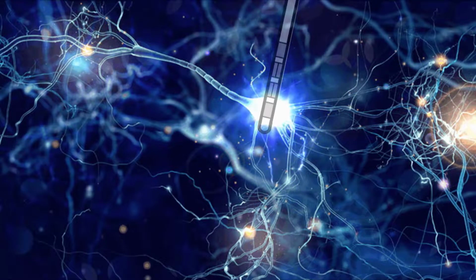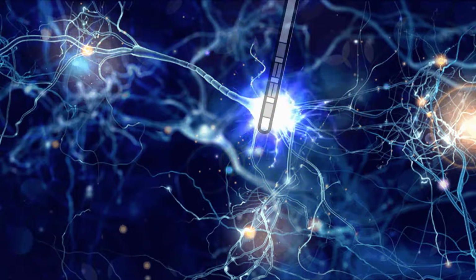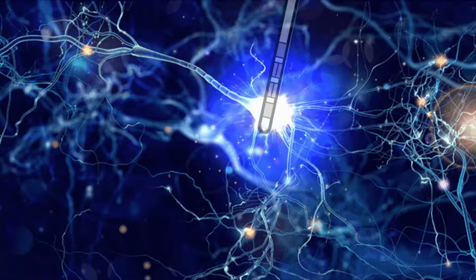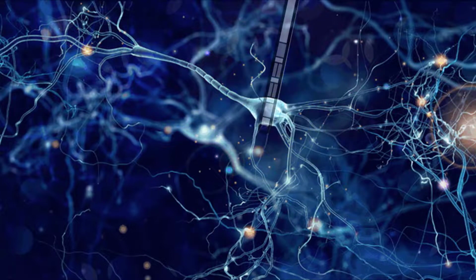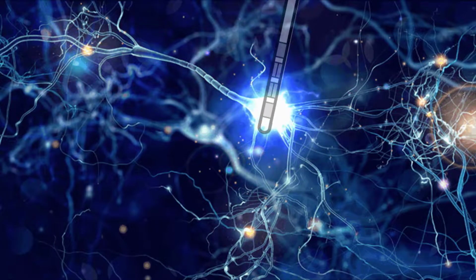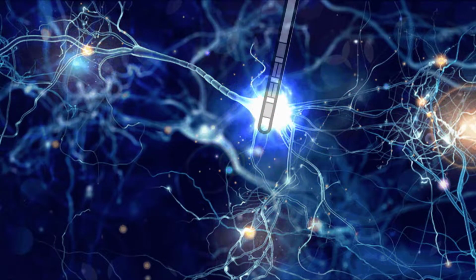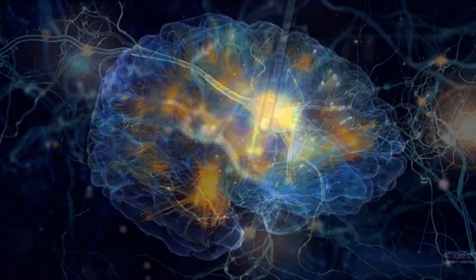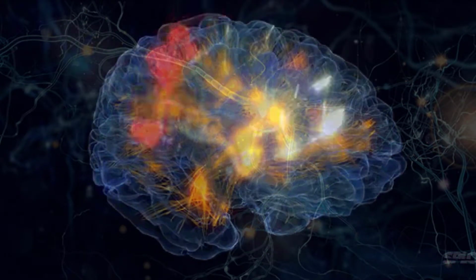However, we need to remember that there are no specific centers in the brain for tremor or other such symptoms, but these symptoms are caused by pathological activity in various networks in the brain. The stimulation field itself from the DBS electrode will affect an area only a few millimeters away from the electrode, but since we are intervening in networks, this will have effects also far away from the electrode in other areas of the brain.